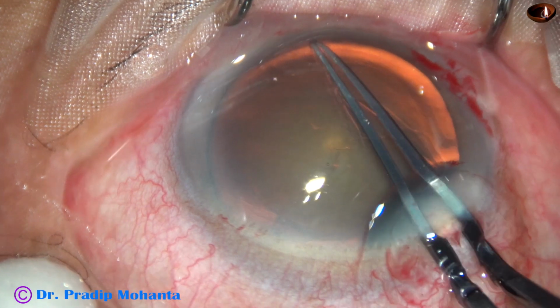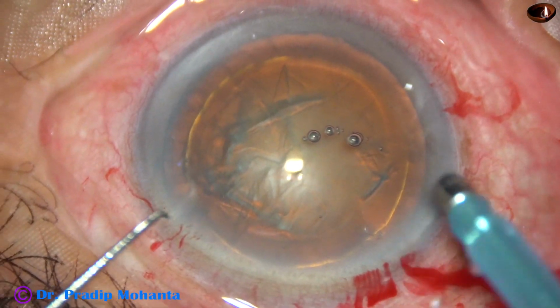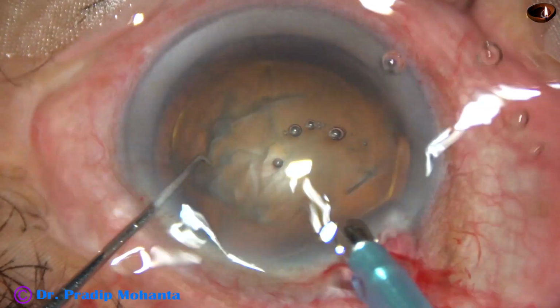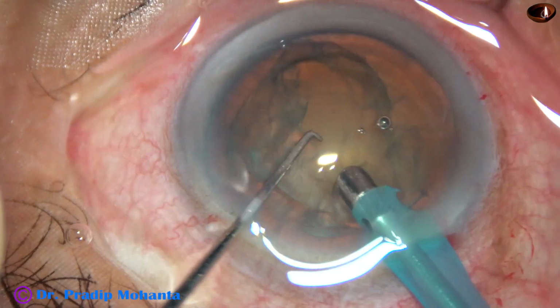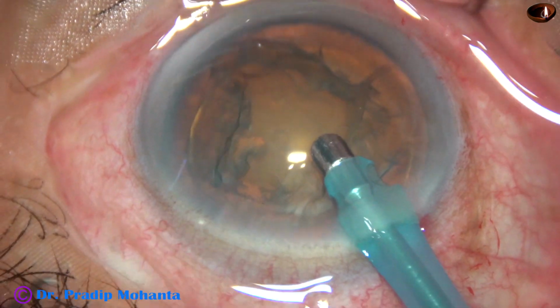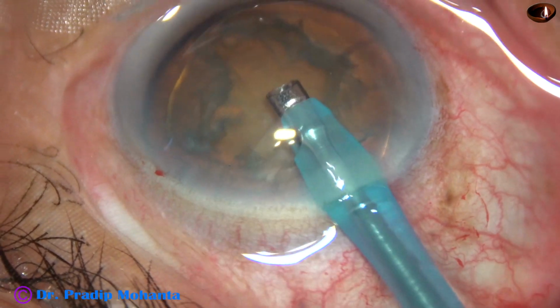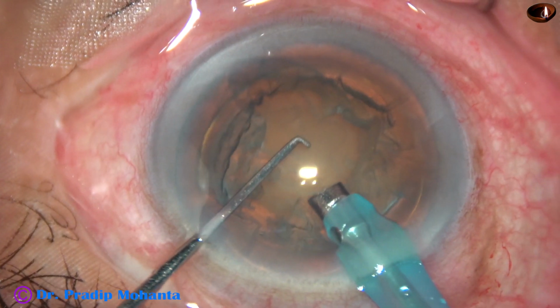Sometimes I do it with a 26 gauge bent needle cystotome. After hydrodissection and hydrodelineation, see the chopper again. You can see very clearly now because the cortical matter has been removed. Yes, this is the chopper.